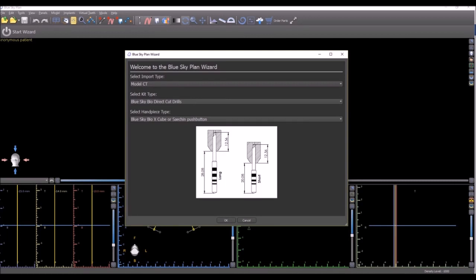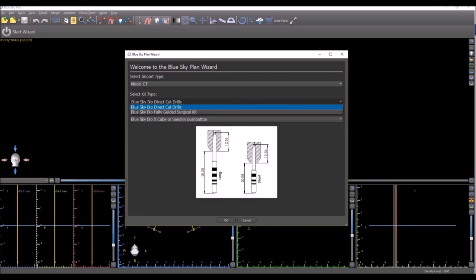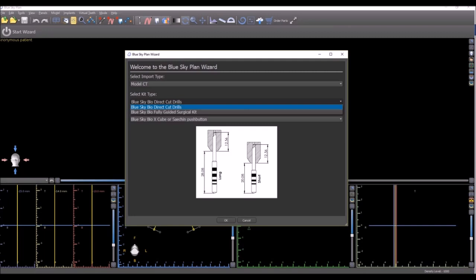In addition, this version of the software now supports multiple surgical guided kits. So you have the option to select which kit you're going to be using. We have the direct cut drills and we also have the new BlueSkyBio fully guided surgical kit. And again, the wizard, including the parts it recommends, including the report that's generated at the end, will modify itself depending on the selection made.